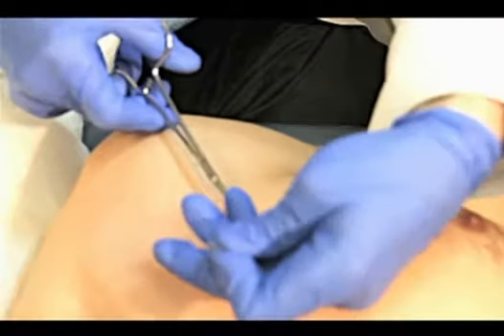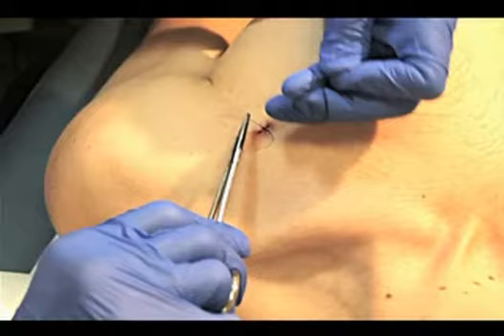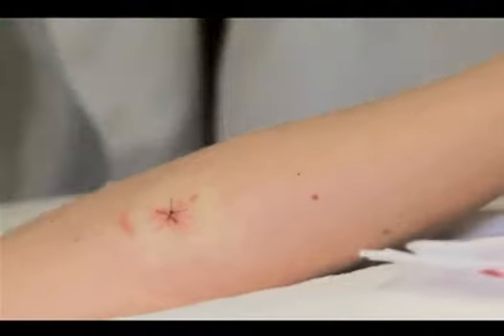Secure the first part of the knot, blotting any bleeding when necessary. Circle the suture in the opposite direction once and cinch a square knot. Repeat these steps for a total of 3 times and then cut the suture at about 1 centimeter.